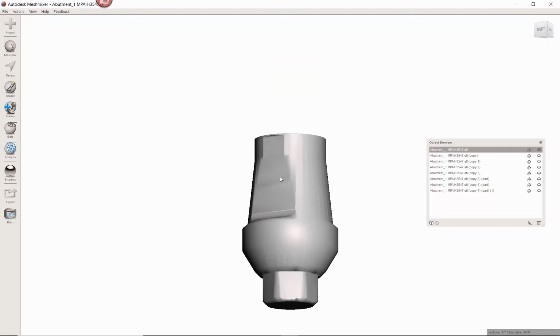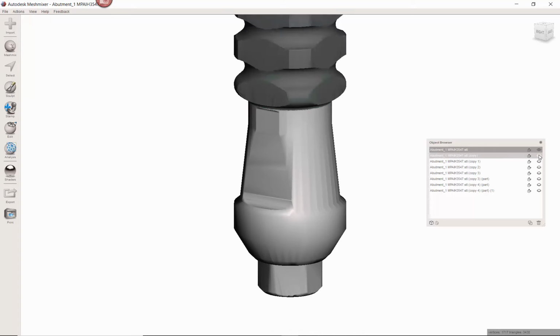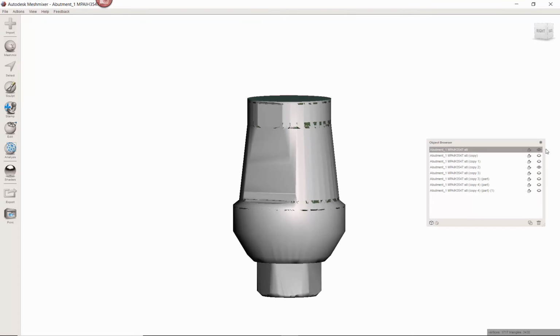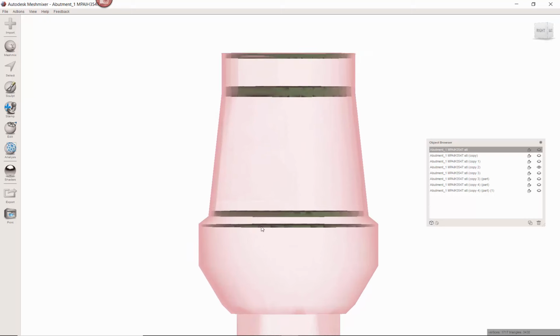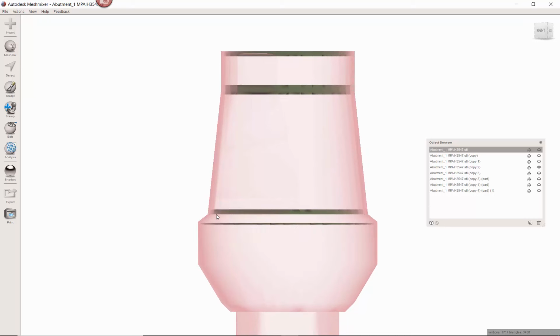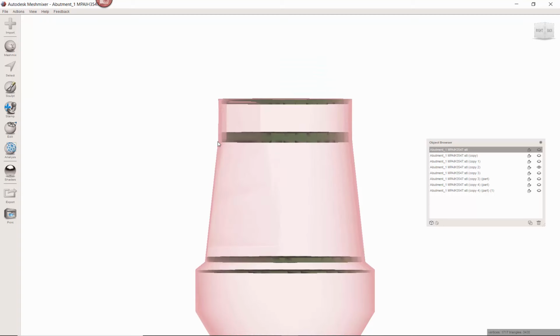And so what I've done in the software is, again, not something you're going to do. This is just me for demonstration purposes, is I sectioned it into a bunch of pieces, okay? Most importantly, I'm going to show you these little pieces. Well, I'll go ahead and just turn this off. So you can see the abutment, and the parts that are important to me are first the margin area right down here. I've made like a little disc at that area. Then right at the very initial of the transition, I've made another disc right there. If you look, there's another transition right here. So I made a disc there, and then the very top.